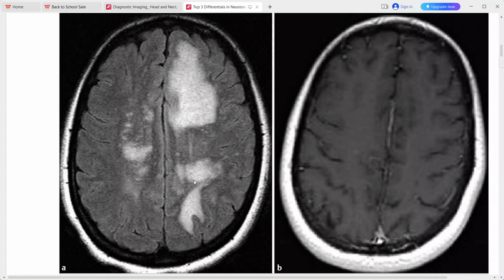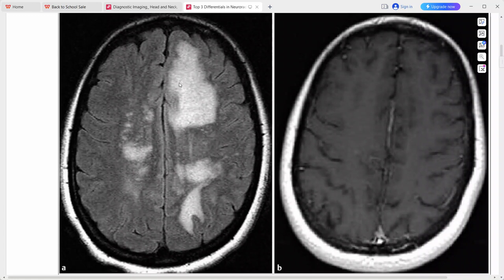There are extensive regions of hyperintensities predominantly involving the white matter bilaterally, but predominantly on the left hemisphere. The white matter is involved here and there is no enhancement on the post-contrast sequence, giving us confluent white matter signal abnormality in an adult.